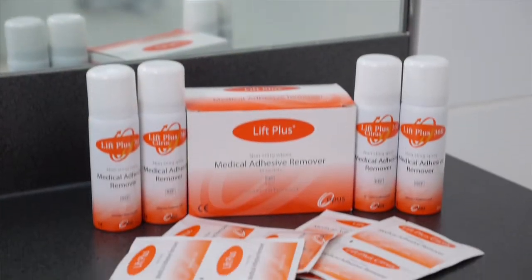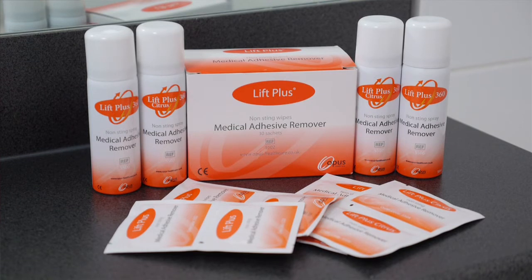The best product in my regime is definitely adhesive remover, and I use the Lift Plus 360. You can get this unscented or scented with citrus. I prefer the citrus scent because I just like the smell, and sometimes ostomy contents can be quite smelly, really, to put it bluntly.